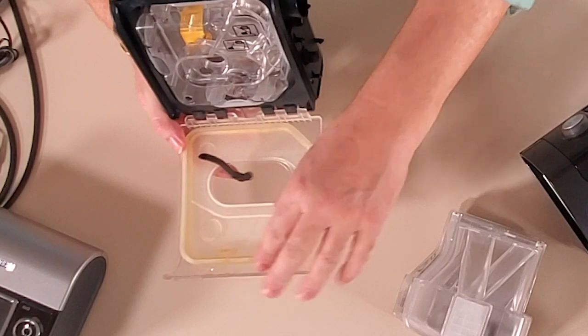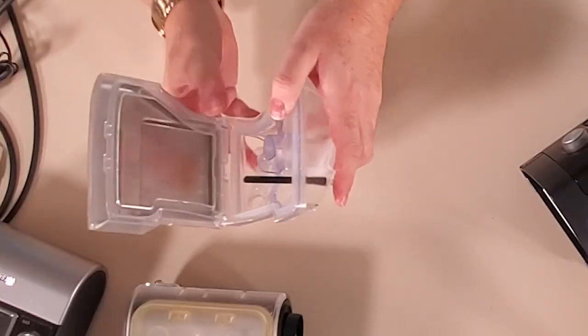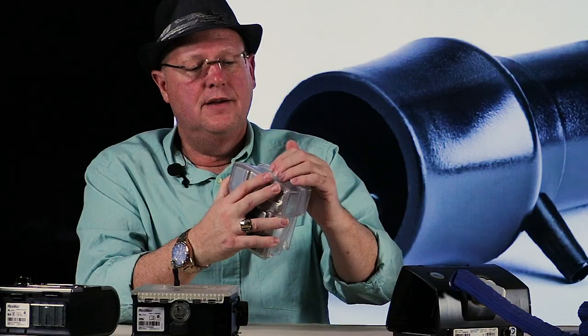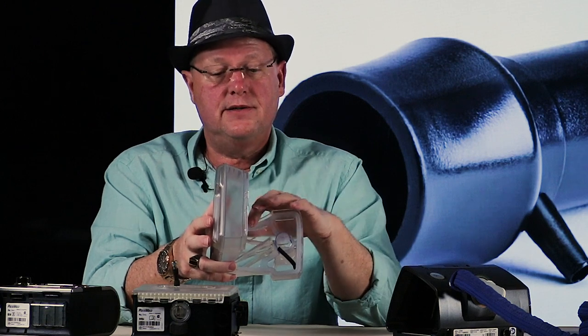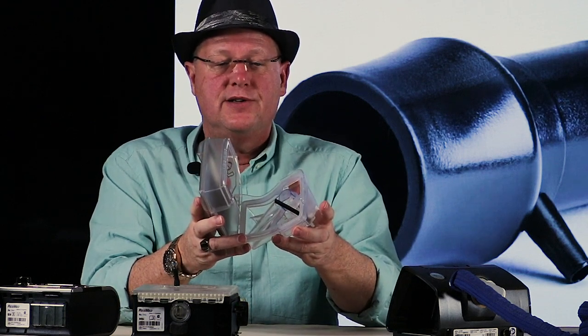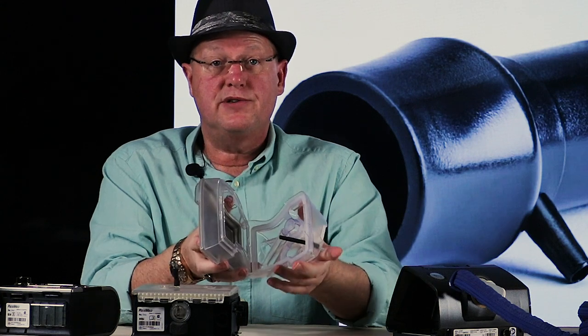I think the discoloration happens because on the S9, the entire top surface is gasket material — so a large amount is unnecessarily exposed to ozone. On the newer S10, the gasket only runs around the edge where it makes the seal. Despite both units being used for the same duration, the S10 gasket still looks great. I suspect manufacturers are catching on to ozone cleaners and designing gaskets so that minimal surface area is exposed to ozone.